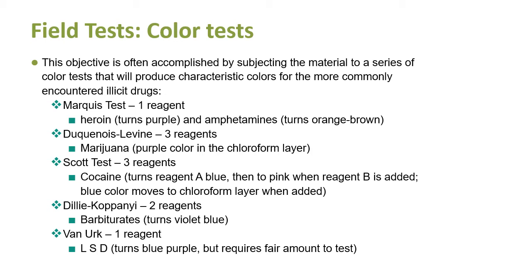And then we have the Dille-Koppanyi test, which is for barbiturates that turns violet blue, and the Van Urk test, which has one reagent, it tests for LSD and it turns blue purple. Unfortunately, with the Van Urk test, you have to have a fair amount of substance. LSD is a very potent drug and often found in very tiny quantities, and those quantities may not be enough to get a positive color test.